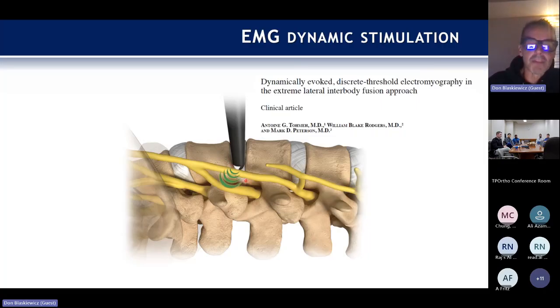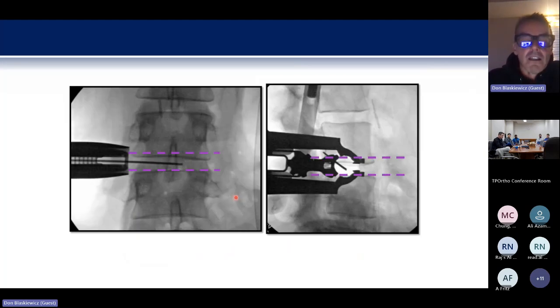Just mentally think what kind of signals you'd get if you were in this corridor here. You'd get low values in front, low values in the back, and that should mentally imply you have to pull out, come anterior, and then sweep all that back. Once you get down in here, make sure you're working in the plane of the disc space, looking down the pipe of the disc space from the lateral view, not in one direction or the other.